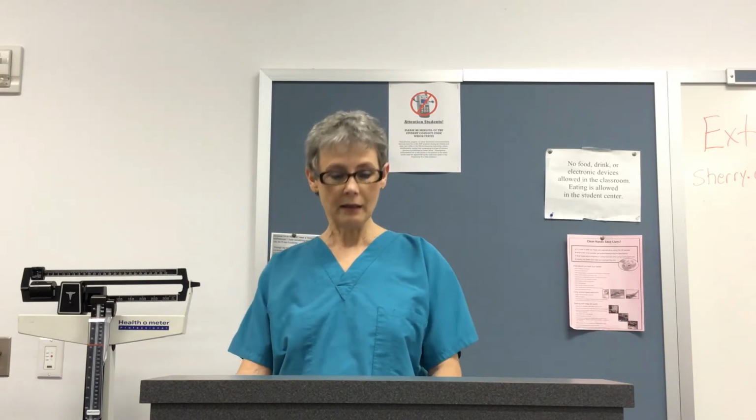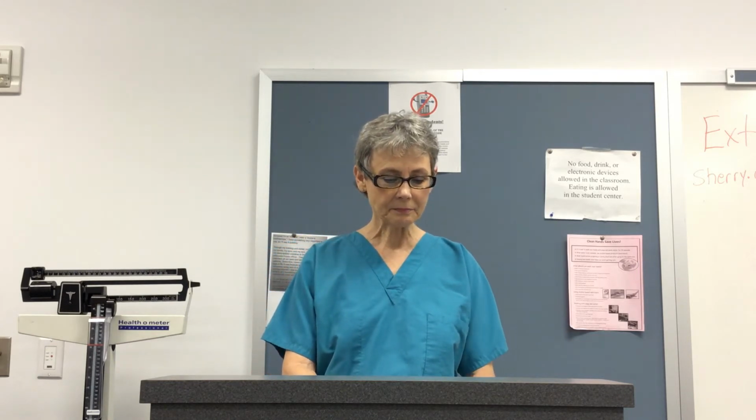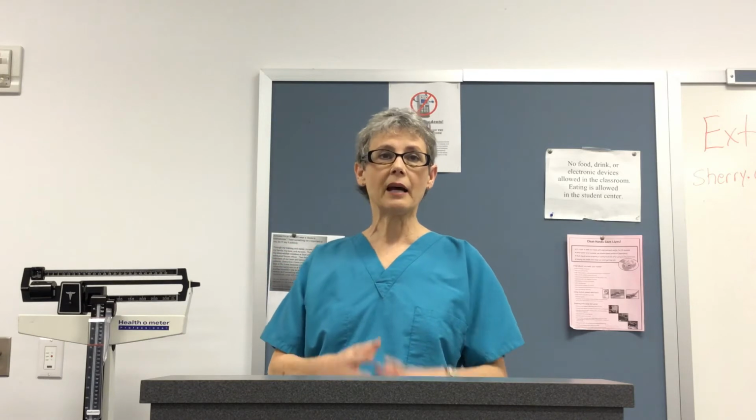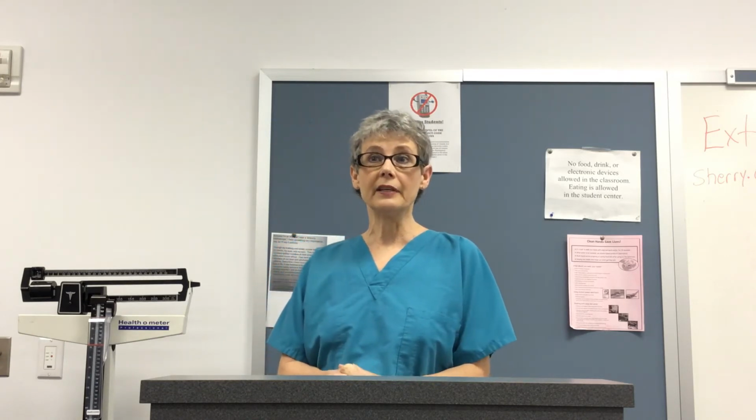And before we go any further with some of these expected outcomes or complications, let me talk a little bit more about the air. Many facilities use pumps, and this is not going to be a major problem because these pumps are so sensitive to air. If a little air bubble gets into that line, it is going to alarm and it will not run.